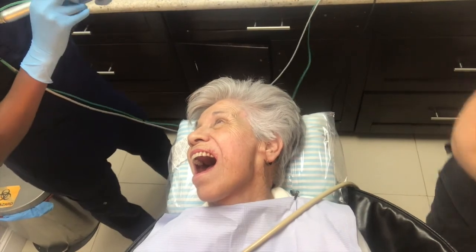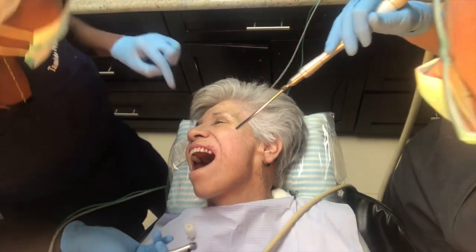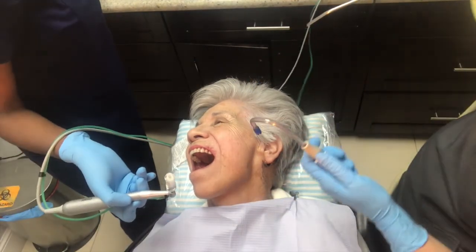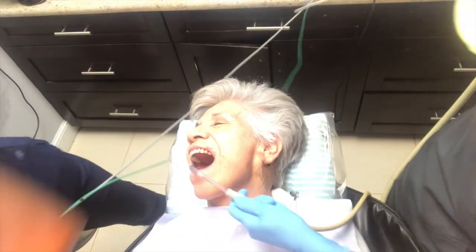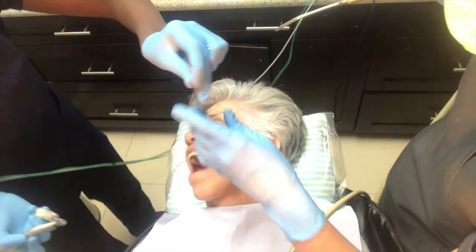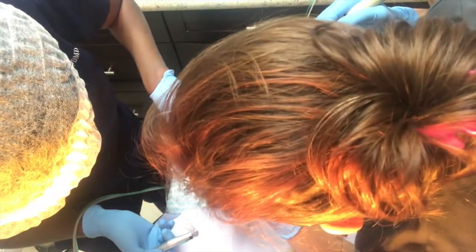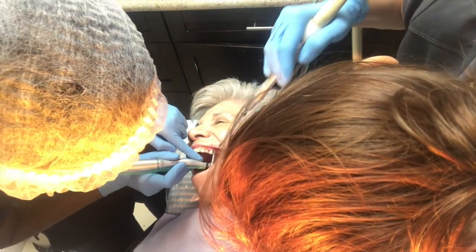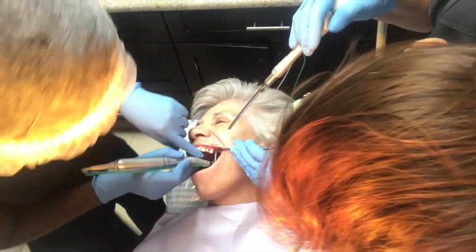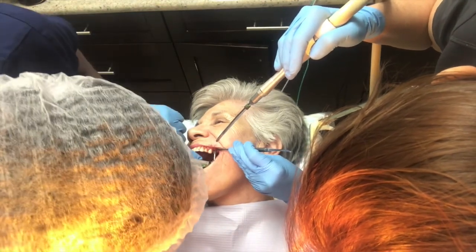So I've done all the drilling. You can see it upside down in that container. I open up the area. I keep the implant covered right up until the moment you'll see me in a minute just drop it onto her bib on her chest and then place the implant in right away. The drill speed when we're doing the initial drilling is really fast. I dropped it really quick. You couldn't even see it then, but the drill speed is really fast, about 1200 RPMs.